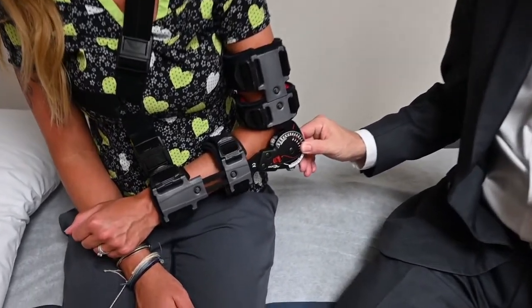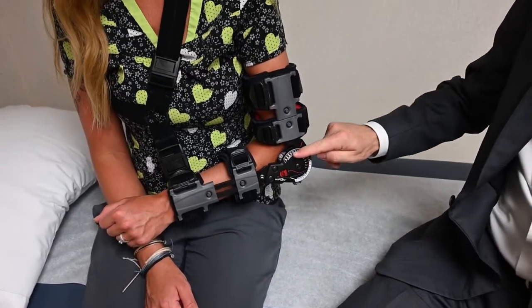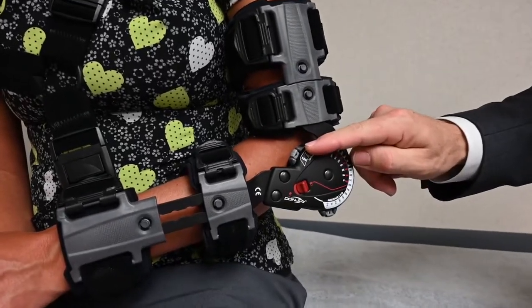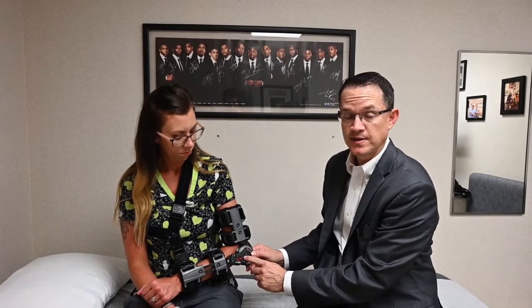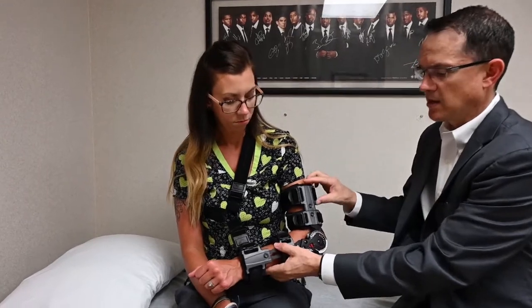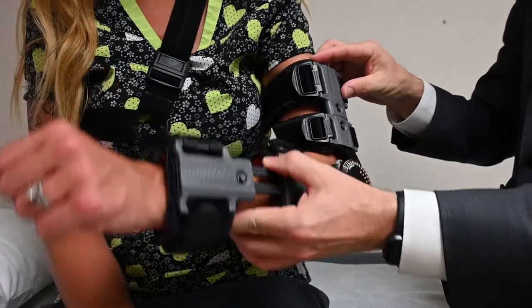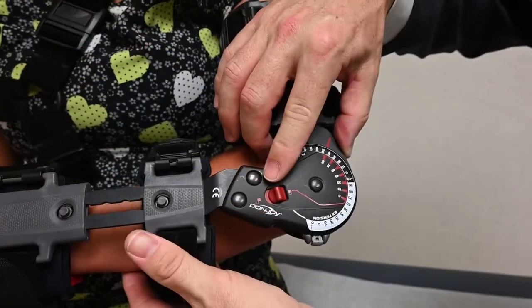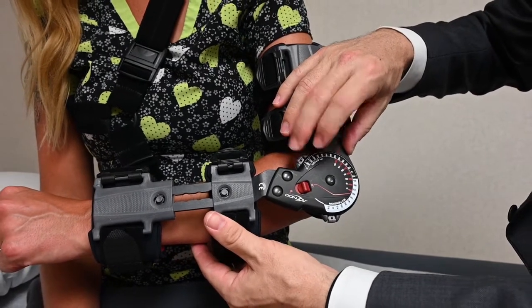At one week post-op, you will return to my office so that we can discuss beginning range of motion exercises with the brace in place. In order to do that, we're going to want to make adjustments to the dial. This is the lock button. Currently, the button is set to be locked. If we move it forward, the brace is now unlocked and will allow basic range of motion of the elbow. I'm going to initially lock it so that we can discuss how to make adjustments to the range of motion of your elbow using the brace.